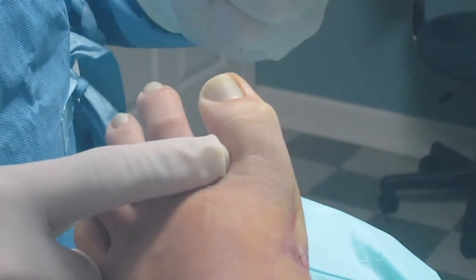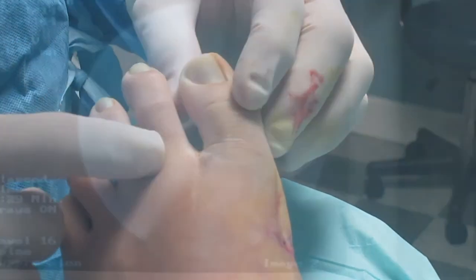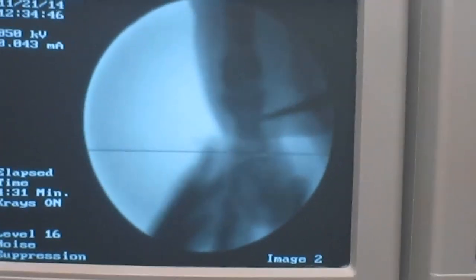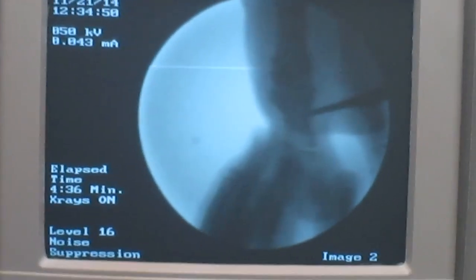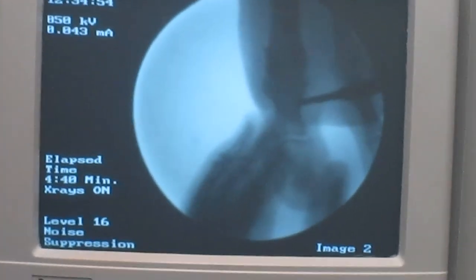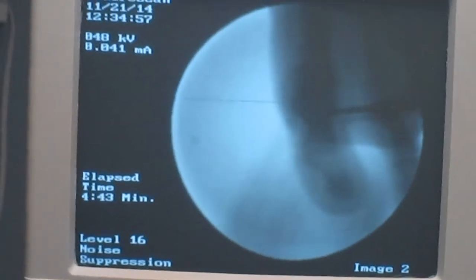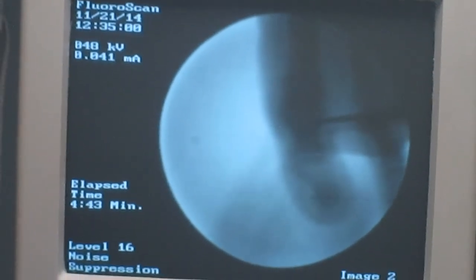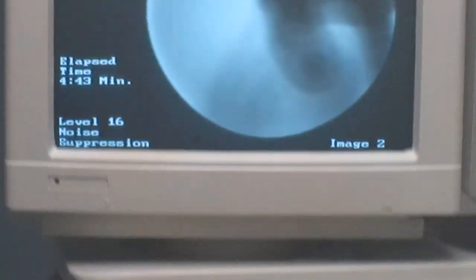Now this is all under the C-arm. So I'm going to show you how we make sure we make our placements in the right position. Incision right in this area right here, and we're doing this under fluoroscopy. So we're going to do a percutaneous incision down to the bone. Now, some people go ahead and use a 67 blade to dissect, which you can do. What I normally do is take this instrument here, a smaller rasp, and go through there.